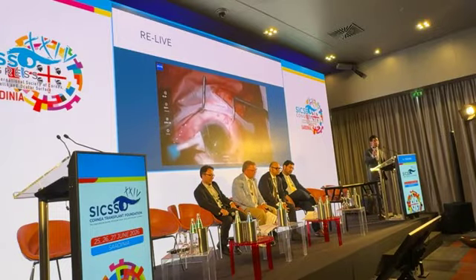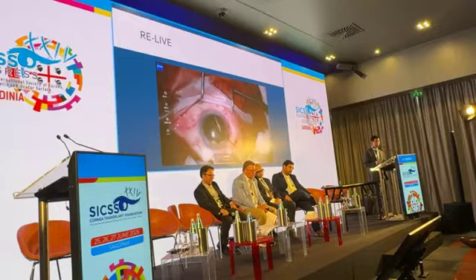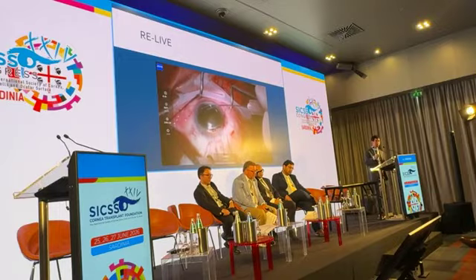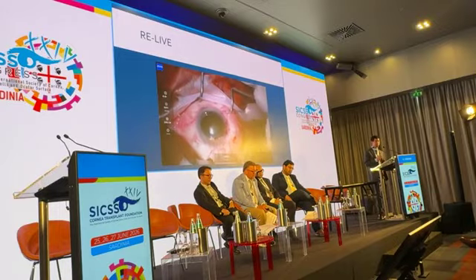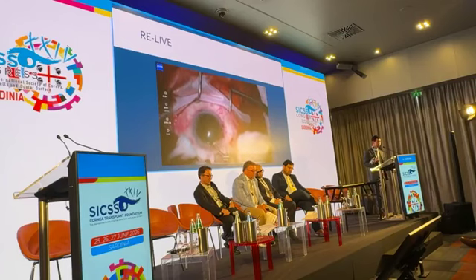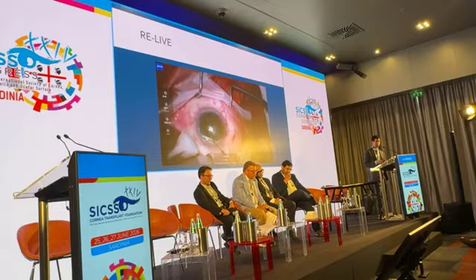And I'm also careful about which part of the cannula I'm using, so I don't use the tip. I'm careful to use the elbow part, or closer to the elbow part as well. So here is just what you were saying. During this part, I have to be very careful to use firmer, slower pressure from the center out to get the last, hopefully, fluid out of the interface. But you can see how smooth it really looks there.